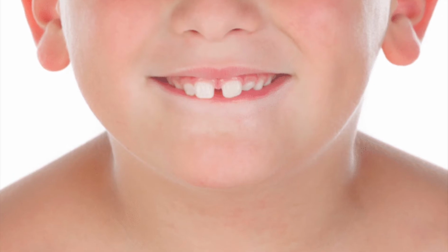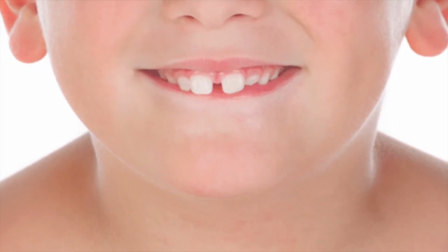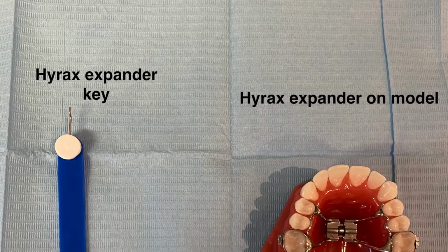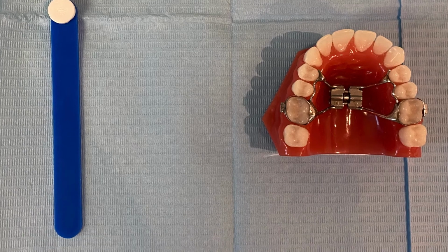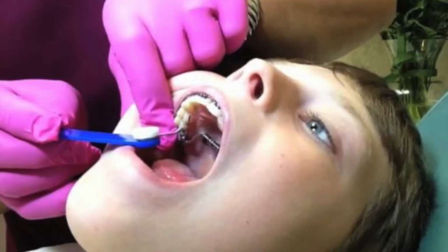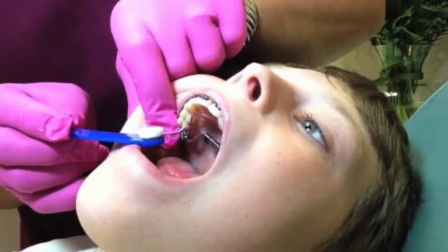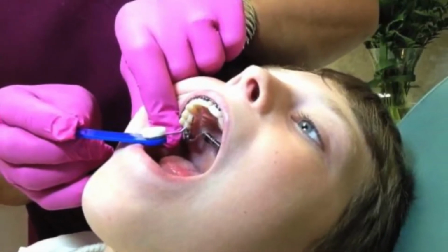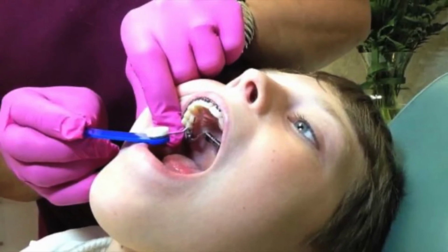By about the 2nd week of activation, you will develop a small space between the 2 front teeth. This is normal and indicates the expander is working well, as the suture on the palate is now effectively stretched. Make sure you lie down either on the bed or the sofa, and you can use a flashlight for better visibility. You would need to activate the expander by turning the key as instructed by your orthodontist.